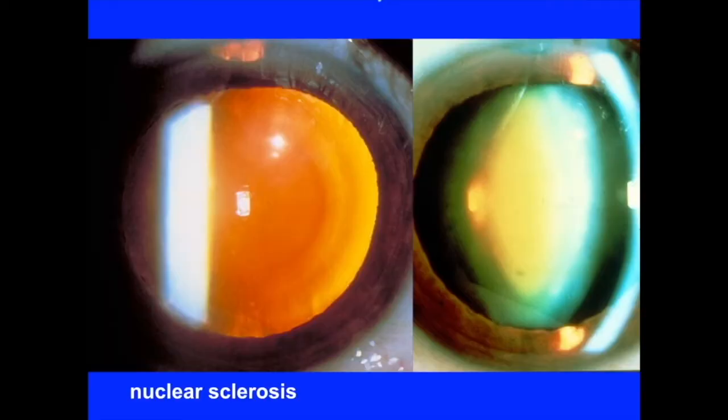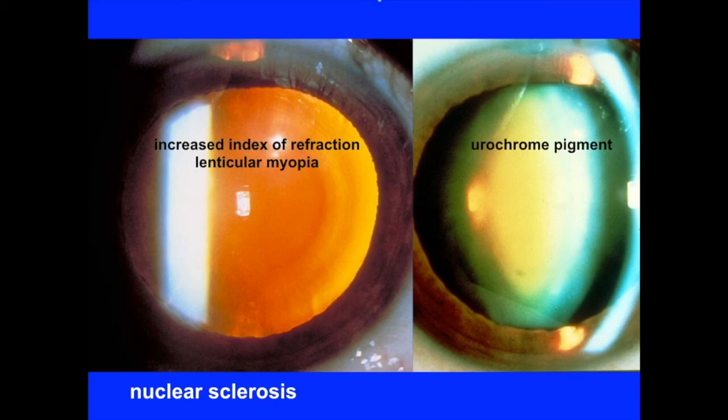These photographs show a sclerotic nucleus cataract that developed after a glaucoma surgery. We see the oil droplet appearance related to increased index of refraction. Again, these can give rise to lenticular myopia. Now, the parallelepiped shows the urochrome pigment in the nucleus. Again, this can be a concern for blue color defects.